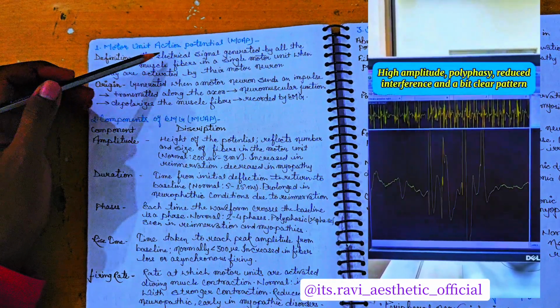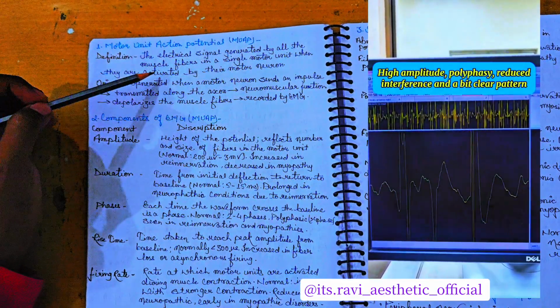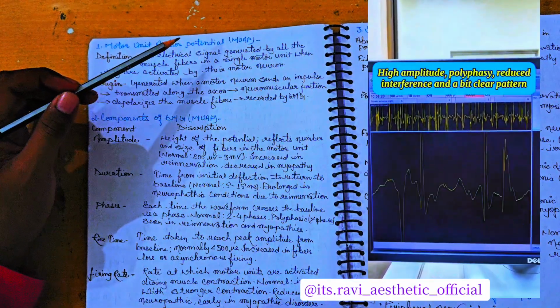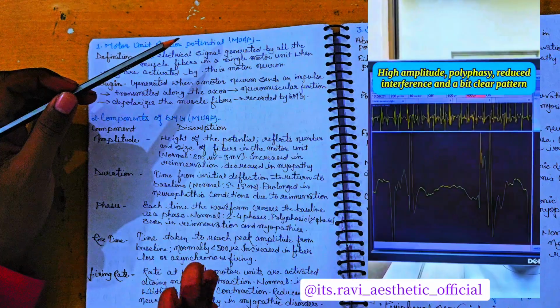So what is the definition? The electrical signal generated by all the muscle fibers in a single motor unit when they are activated by a motor neuron. The motor neurons generate electrical signals in the single motor unit from the spinal cord, and they can be shown on the electromyography.